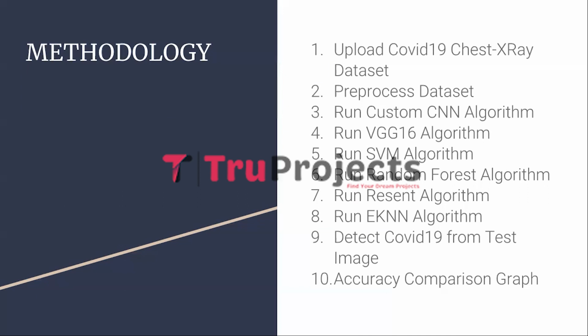This module allows the users to upload a test image which will be processed by the trained CNN model. The model predicts whether the image shows signs of COVID-19 infection or not.